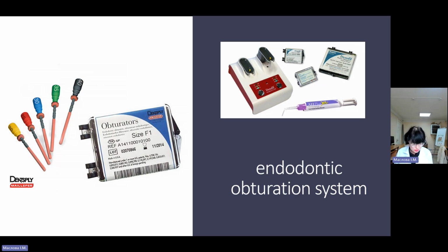protective properties. The thickness of the temporary filling is another factor which contributes to its sealing ability. The zinc oxide eugenol type temporary filling should be at least 3-4 millimeters, and if at all possible, 5 millimeters thick. The root canal will then be well protected for several weeks. If longer periods of protection are required, reinforced zinc oxide eugenol materials like IRM cement may be used.